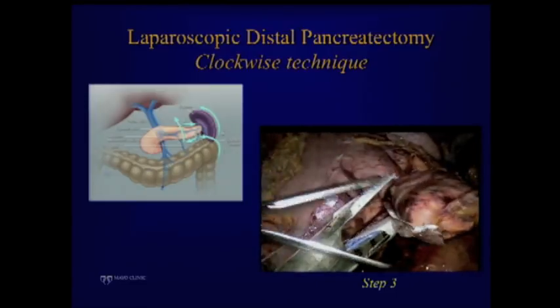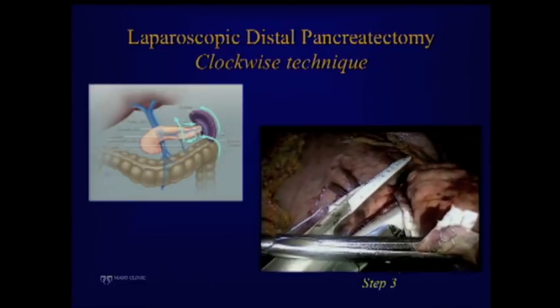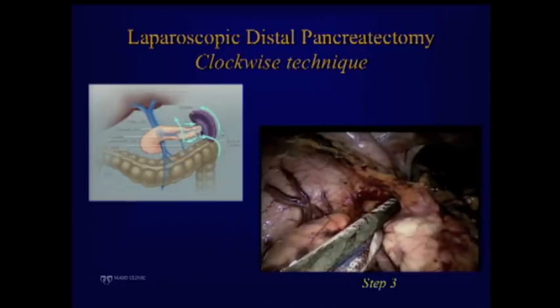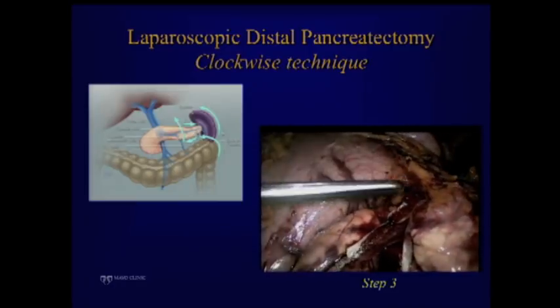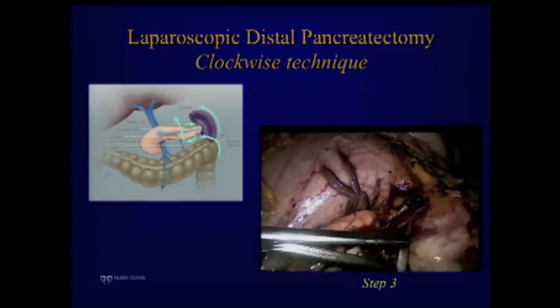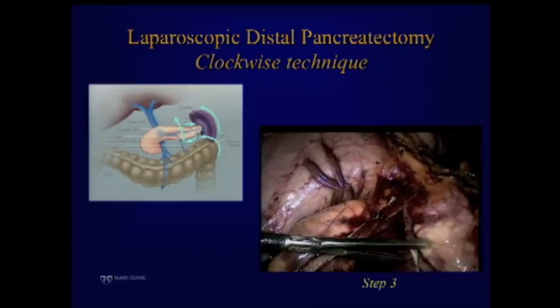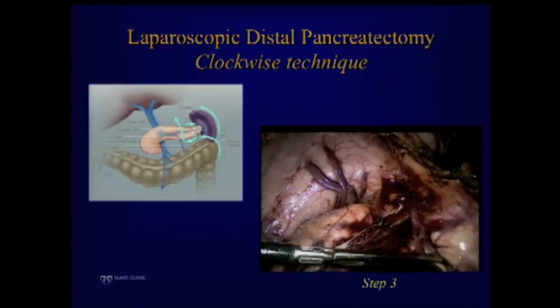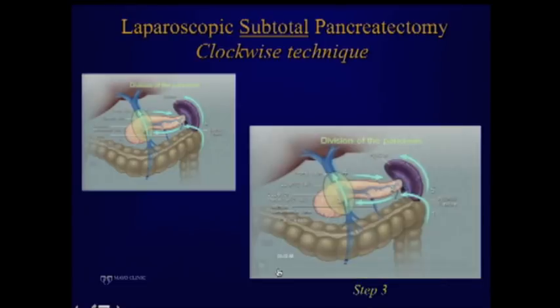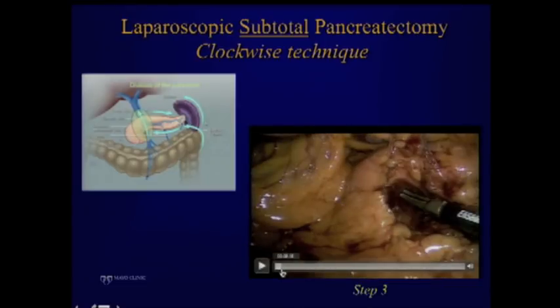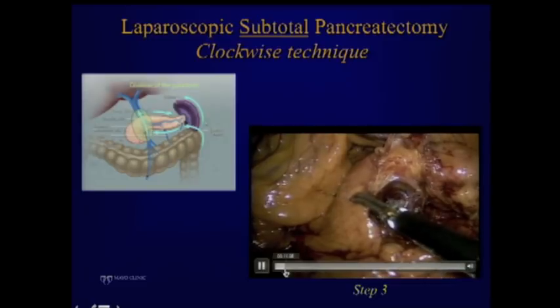After closing, you get a very nice, well-opposed staple line. You don't need to go through the whole pancreas if you don't want to. Here is the pancreas and the artery — we put another stapler, and knock on wood, we have not had any bleeding problems after surgery dividing the artery and vein this way. It's very different if your dissection is close to the neck or the celiac trunk — in those cases you definitely need to isolate the artery.